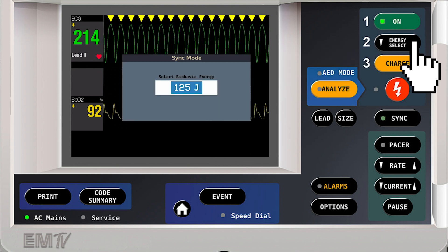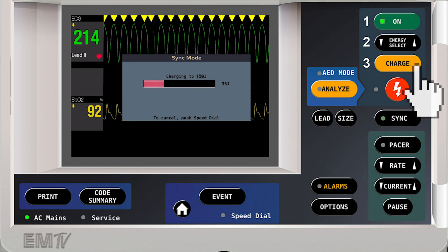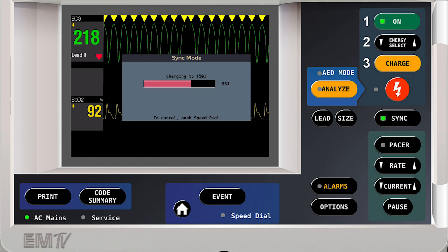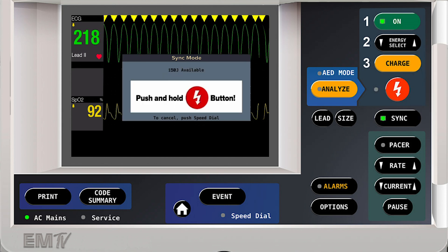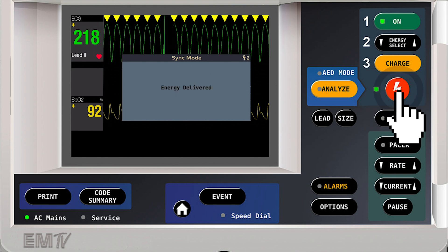Increase my energy and hit charge. Once fully charged, I'll clear my patient and press and hold the shock button to deliver the energy.